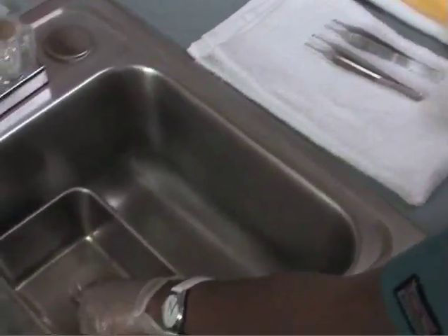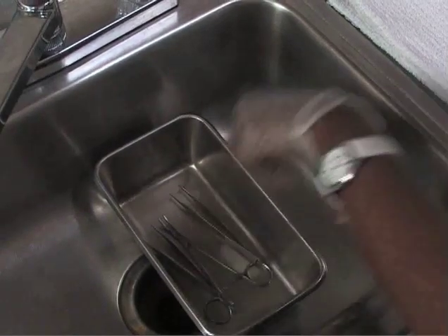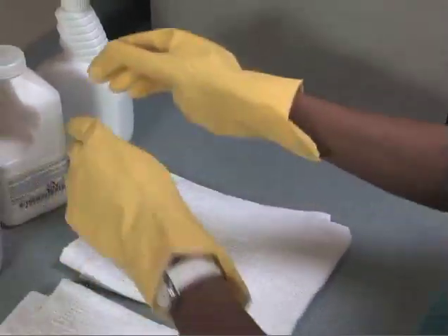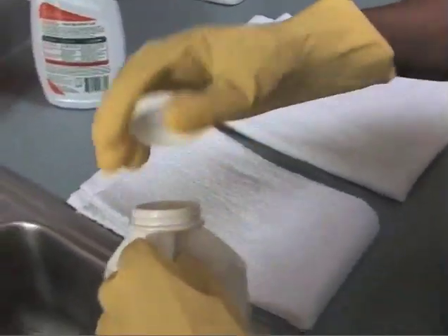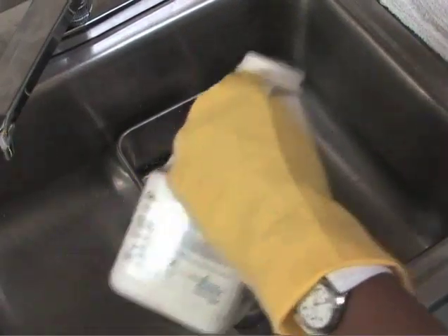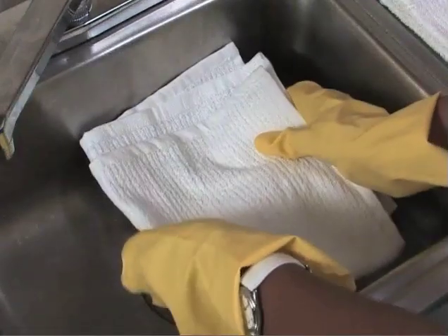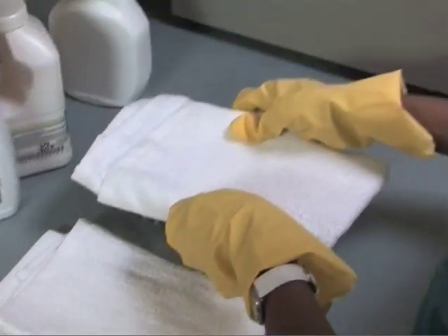Wearing disposable gloves, place the contaminated items in a basin. Once this is done, put on a pair of utility gloves over the disposable gloves. Add disinfectant to the basin, completely immersing the contaminated articles. Cover the container and soak the instruments for the length of time recommended by the disinfectant manufacturer.